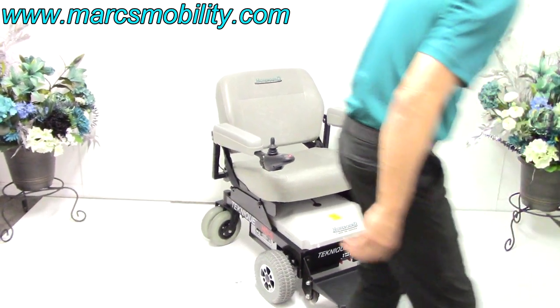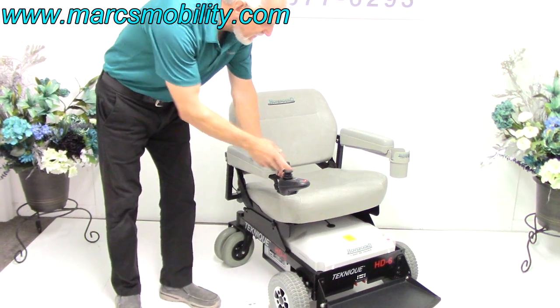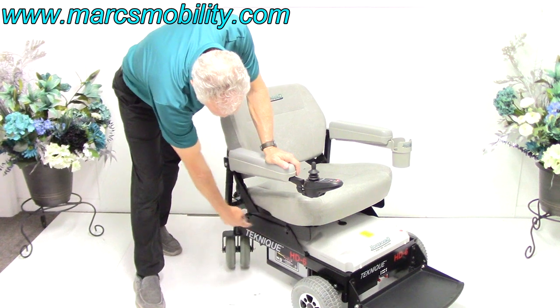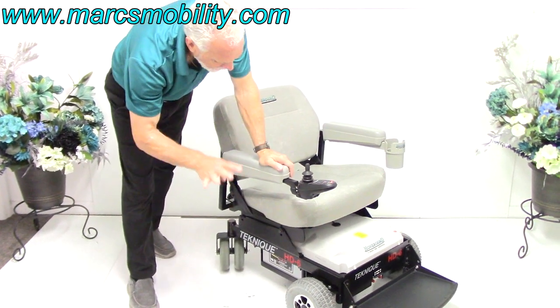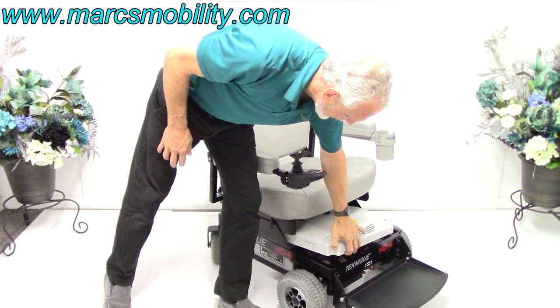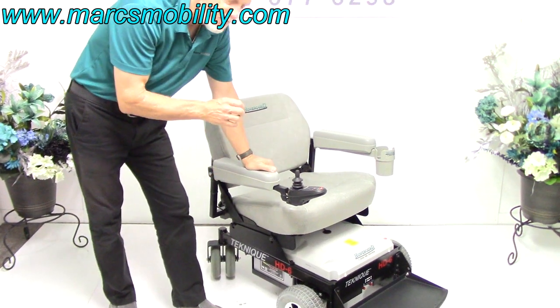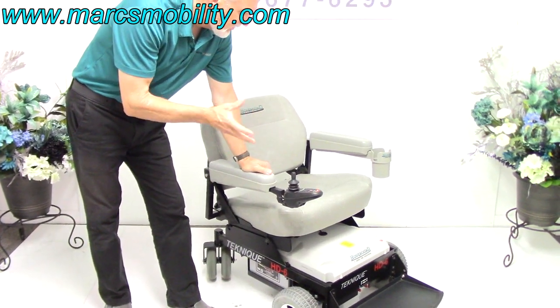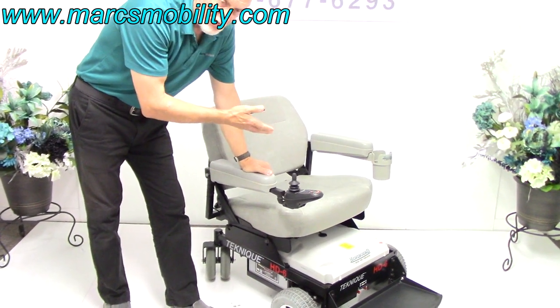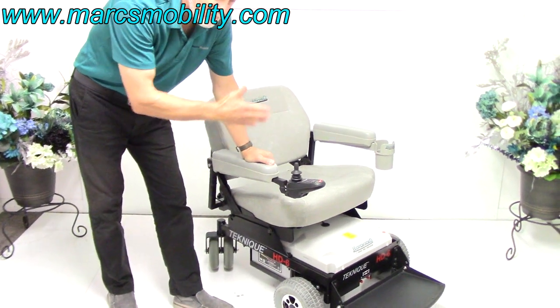This chair takes two 75 amp batteries. If you want to change the batteries in here, you have to take the seat off. There's two screws, one here, two bolts on both sides, four bolts. Take the seat off, pull this cover up right here, and the batteries are side by side under there, and they're 75 amp batteries. And they'll give you about 10 miles on a battery charge. That all depends on the weight of the user, where you're driving this chair, uphill, in the grass. You know, the mileage will vary.